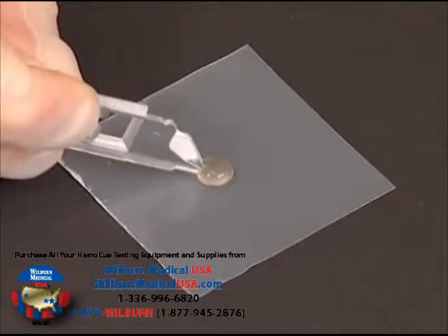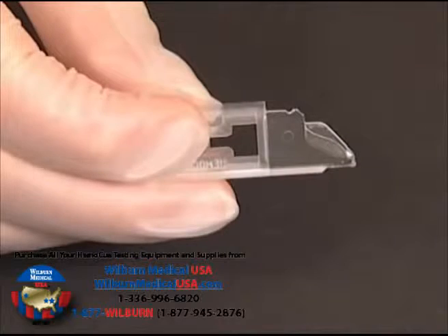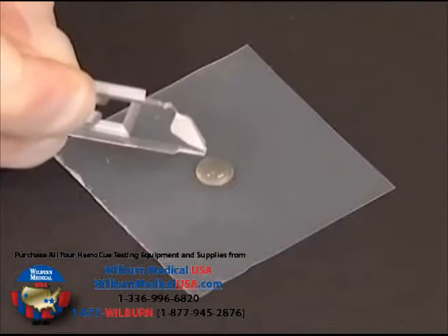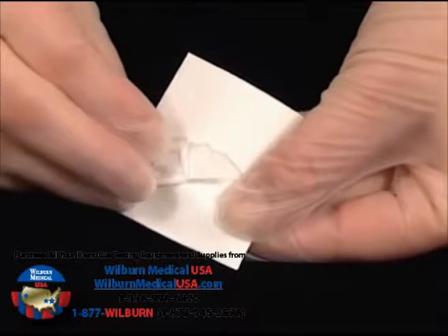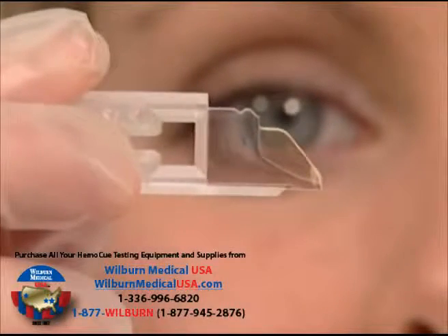Fill the microcuvette in one continuous process. If the microcuvette is not completely filled, discard it and fill a new cuvette. Do not refill a partially filled cuvette. Fill a new cuvette, wipe off any excess urine from the outside of the microcuvette with a lint-free wipe, making sure that no sample is drawn out of the microcuvette during this procedure.